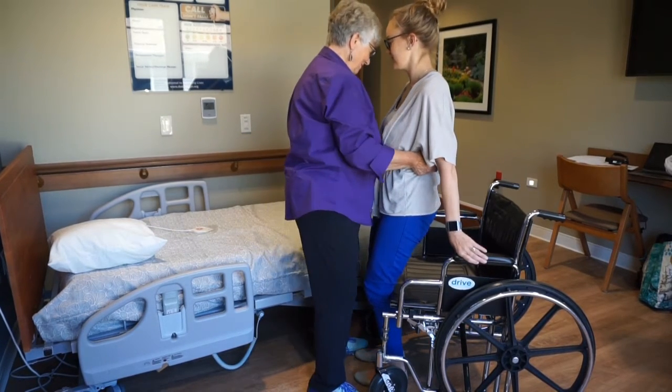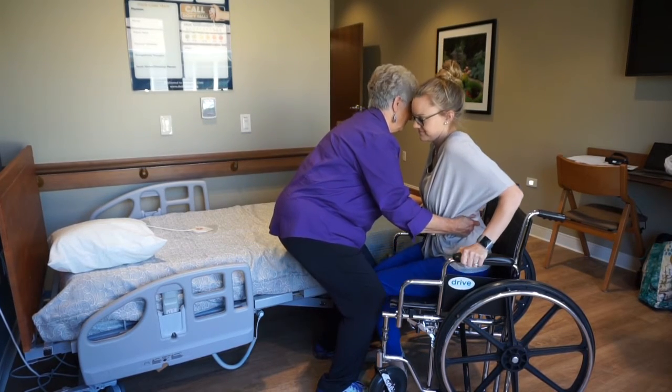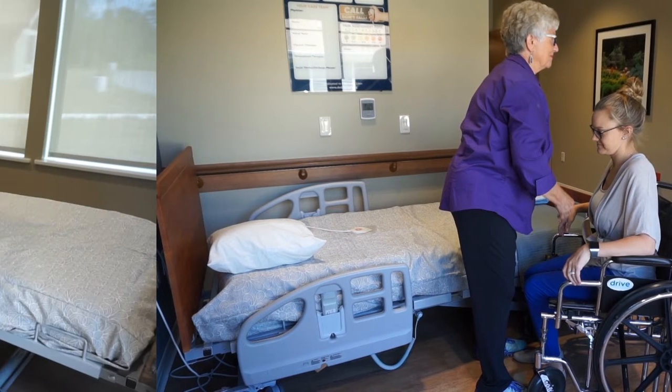Count aloud 1, 2, 3, and on 3, while holding onto the gait belt, slowly bend your knees to lower the person onto the chair. Ask the person to move his or her hips against the back of the chair. If needed, have the person stand up and sit down again into the correct position.